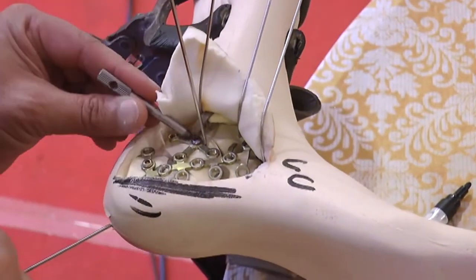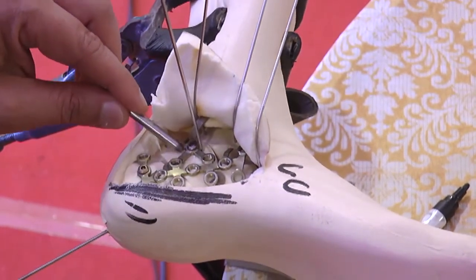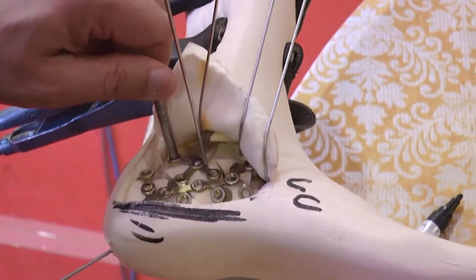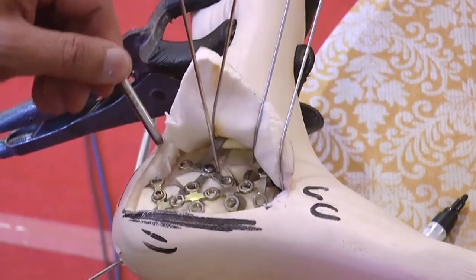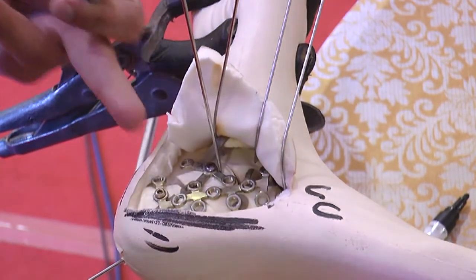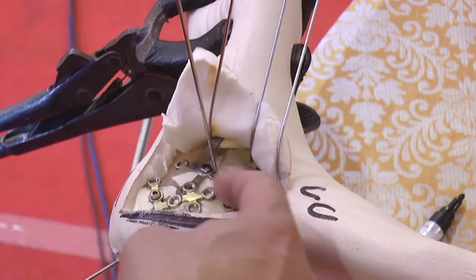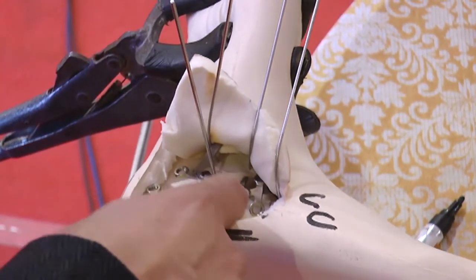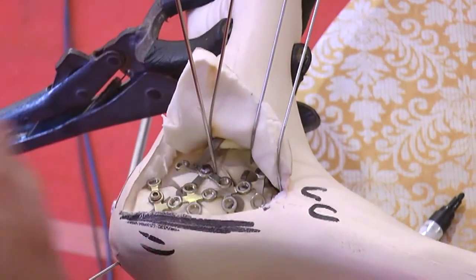Now many times you have to cut off the apex, the arch of this plate. The last screw needs to be cut off, or you can use your locking tower and bend this screw hole onto the calcaneus posterior side, and you can put one screw almost parallel to the subtalar joint, exiting into the plantar side. If you have a fragment on the plantar side which you want to hold, you can use this screw hole to do that job.